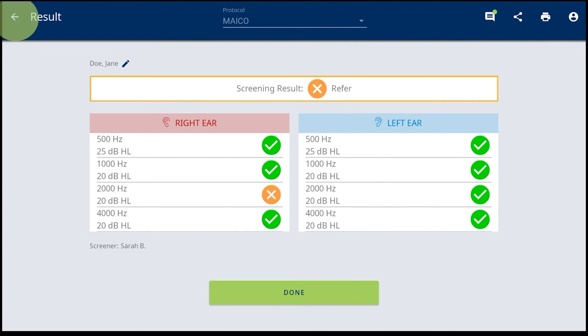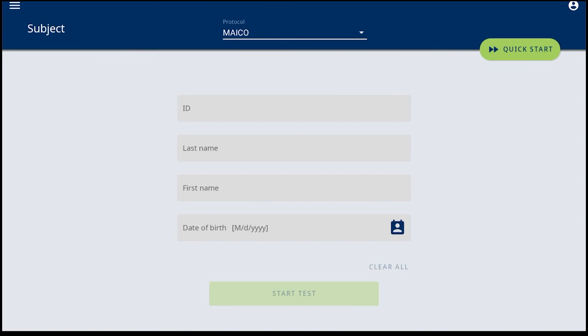The back arrow to return to the test screen. Done will return to the start screen.